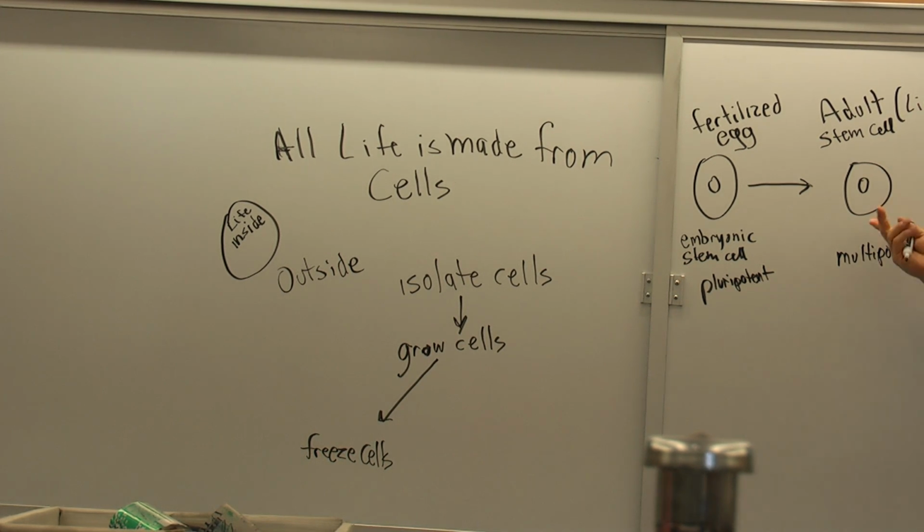So there are actually stem cells in the skin, right? And I was saying that the epidermis is constantly being sloughed off, so you're going to have to replenish that. So there's got to be a pool of stem cells somewhere. And there is. And we're going to be isolating some cells today, in the zone where there are some stem cells, and we're going to try to tease them out.